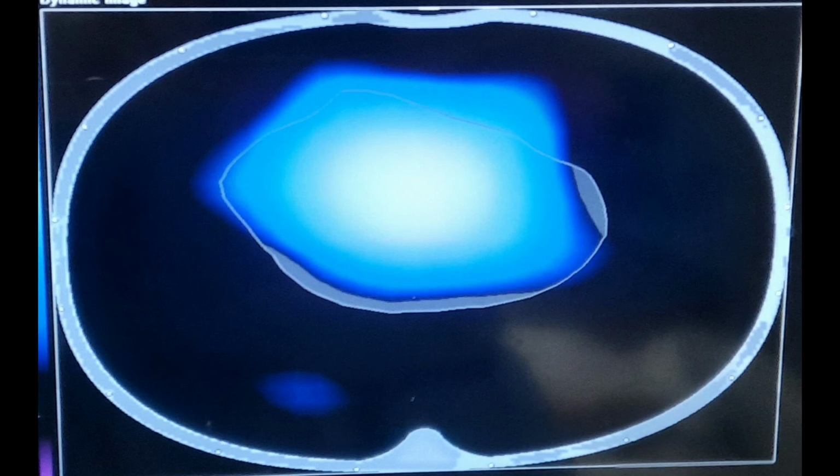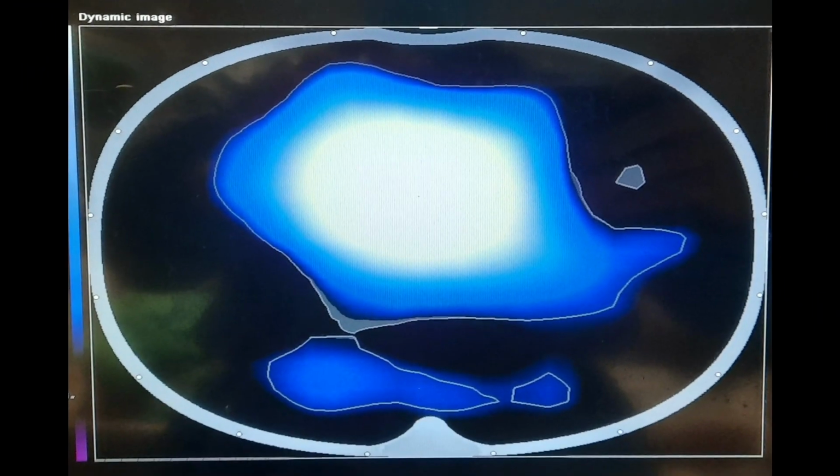The patient was on an FiO2 of 30, the P high of 20 offered a superior mean pressure. There was a long inspiratory time, so the T high was 5 seconds. So we were actually quite surprised when we put the electrical impedance tomography and realized that there was such poor distribution of ventilation. So these kinds of situations, we can refer to this as subclinical atelectotrauma.